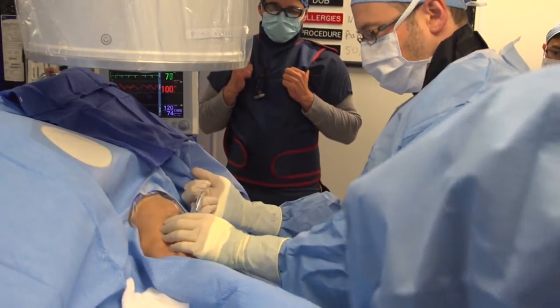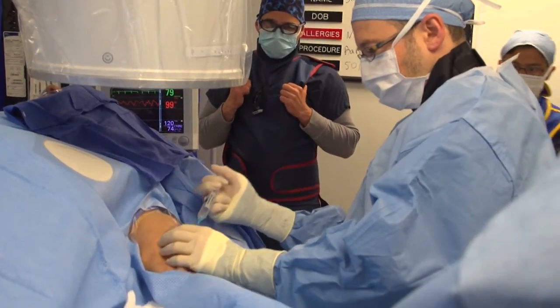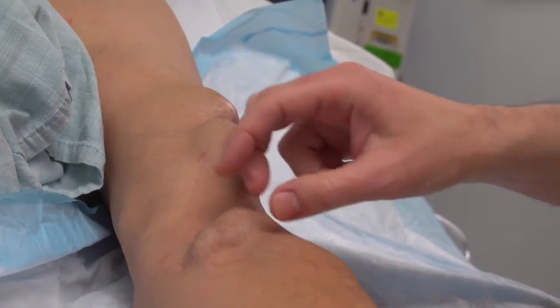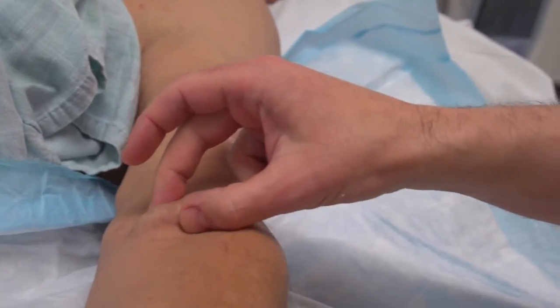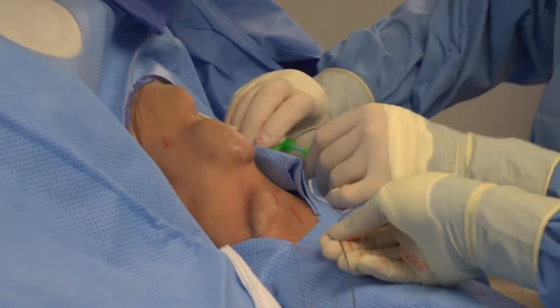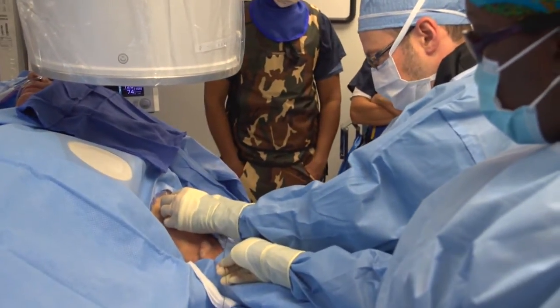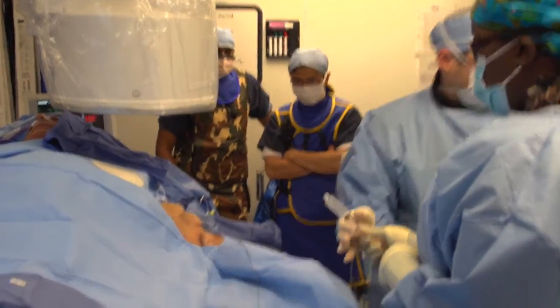First we anesthetize the skin with 1% lidocaine containing epinephrine. To gain access into the fistula we always gain access in both directions. Here you can see the aneurysm; we are evaluating where to place the band. I always pinch the skin to make sure the skin and the fistula body are two distinct tissue planes and not matted together. This is a percutaneous procedure.